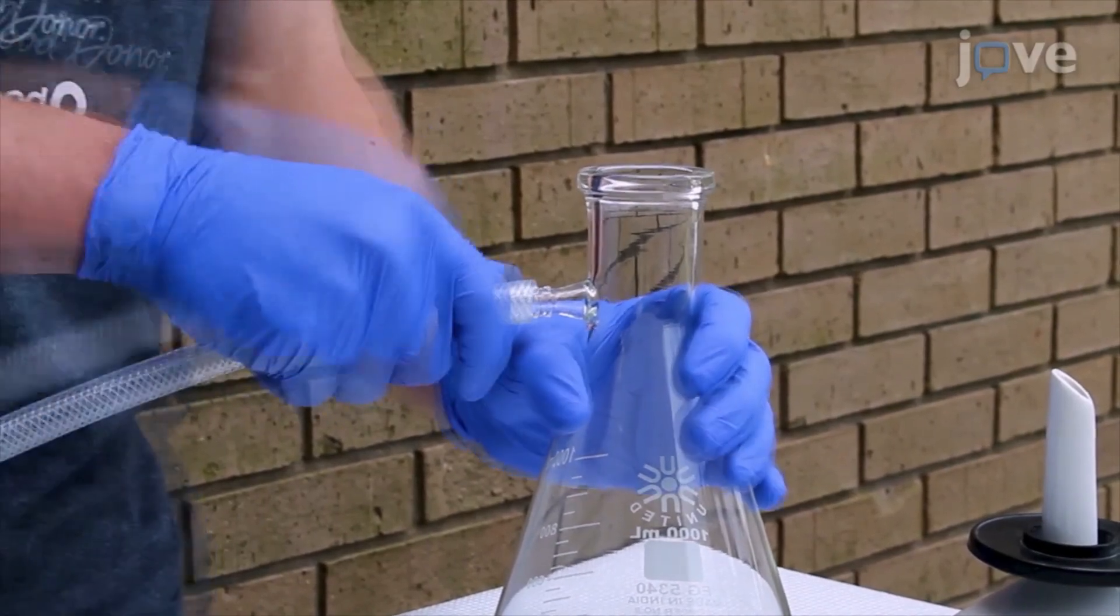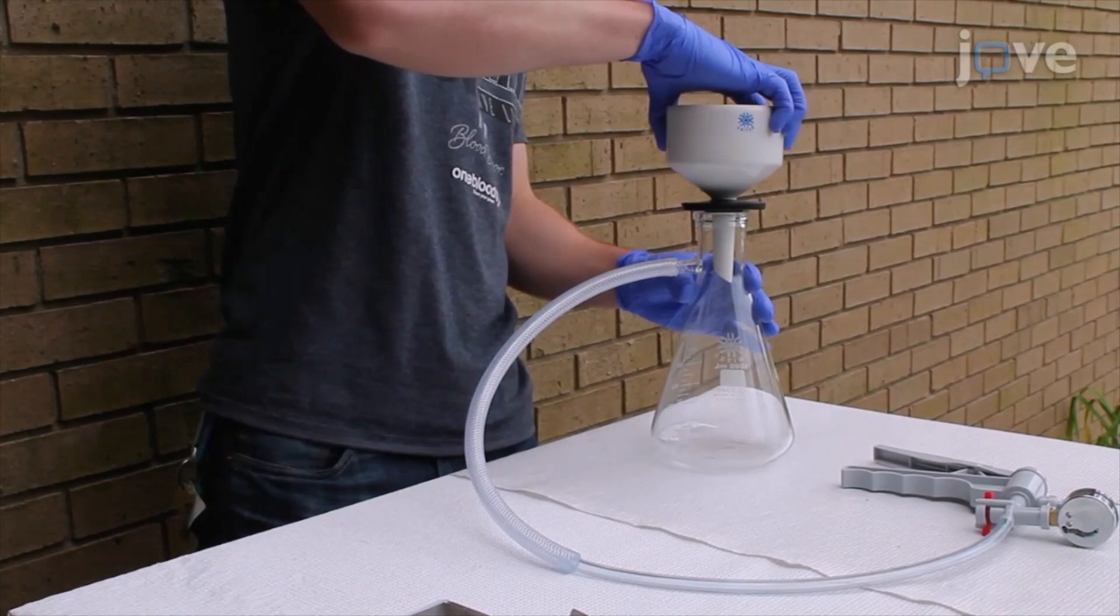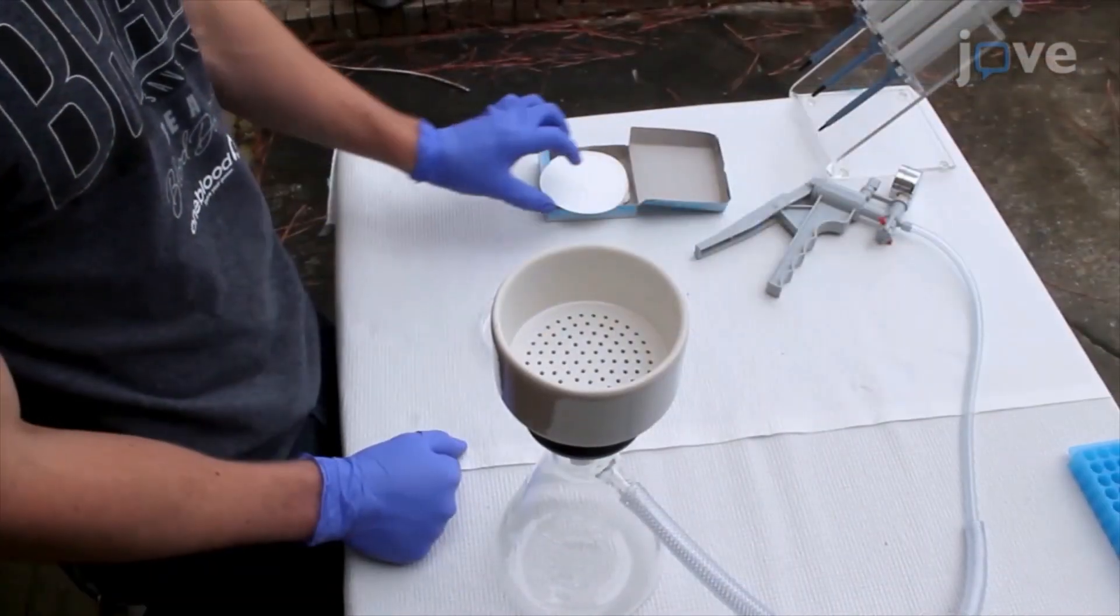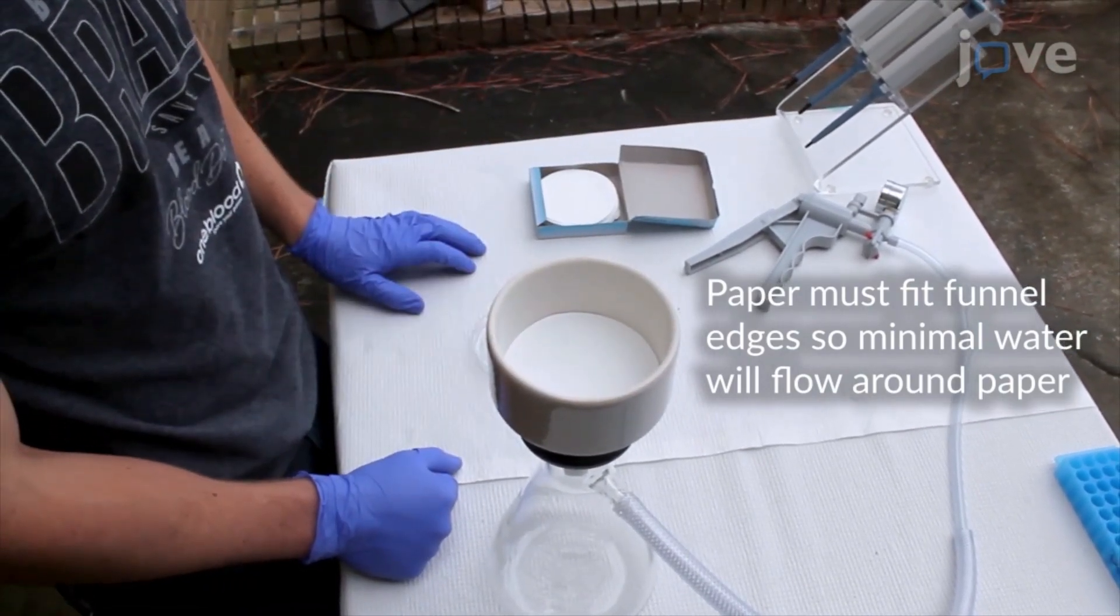Attach a filtering flask to a tube connected to a hand pump and fit a Buchner funnel into the rubber stopper in the mouth of the filtering flask. Then fit an appropriately sized piece of filter paper with a 15 micron retention size into the funnel.